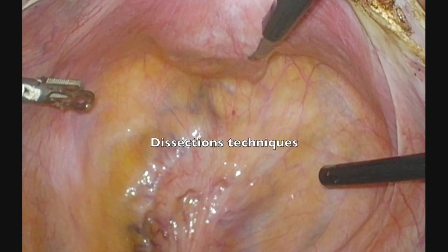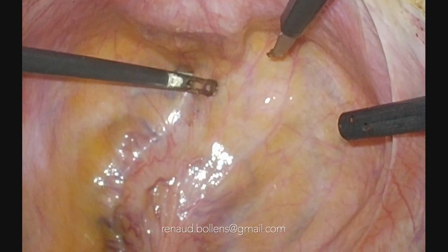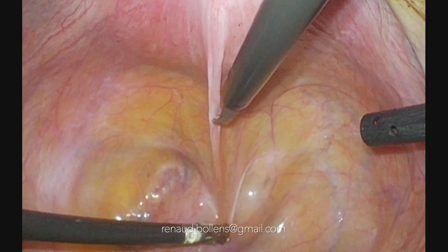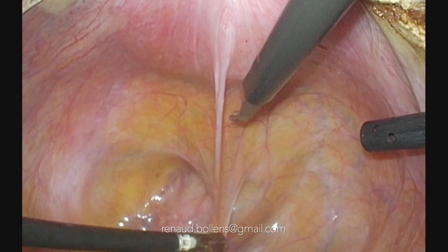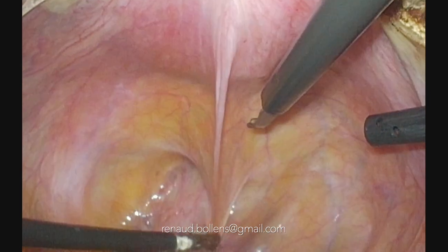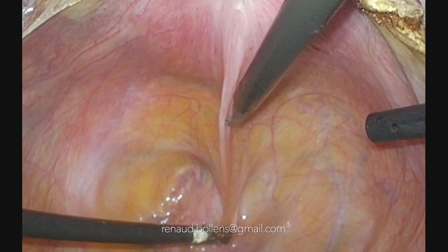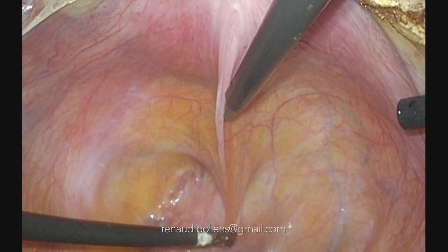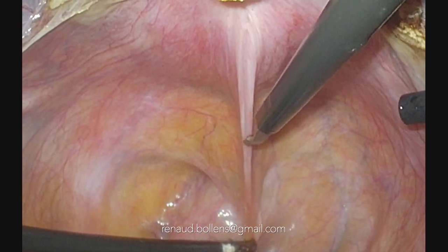Okay. Basic techniques for the dissection. One technique to dissect is to put tension on the tissue and to use the monopolar coagulation. With that, we can cut the tissue. You need the monopolar coagulation, the traction on the tissue, and a small surface of contact. If you have a big surface of contact, you cannot cut, you just warm up or coagulate the tissue. And if you want to cut the tissue, you have to add these three parameters.